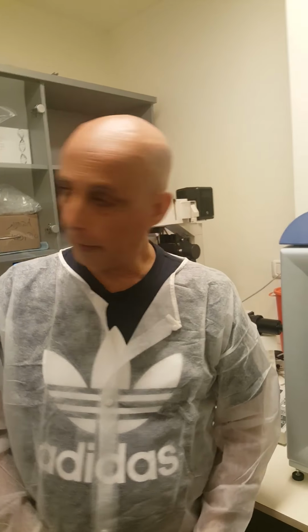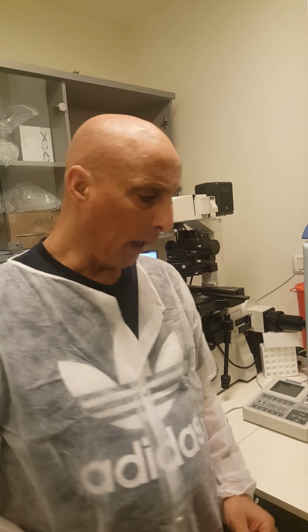What we're doing, we are using alcohol for the hands, 70% alcohol.